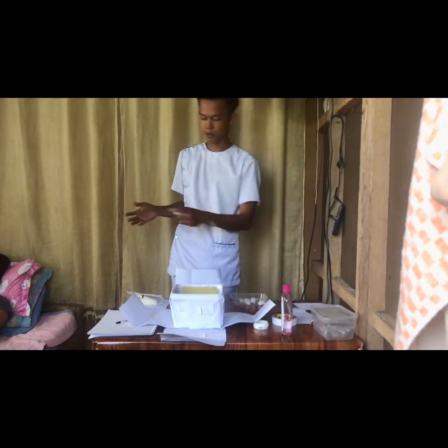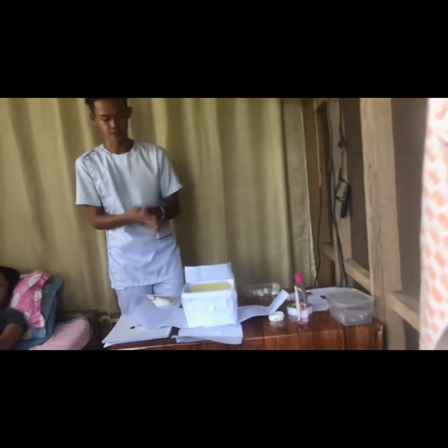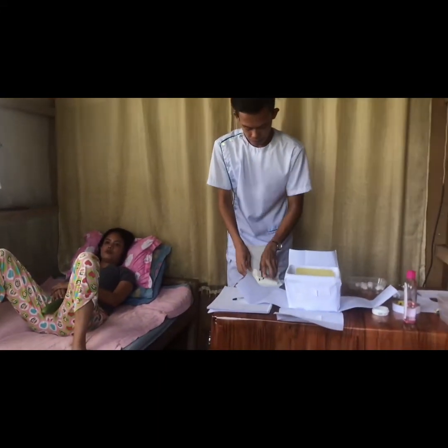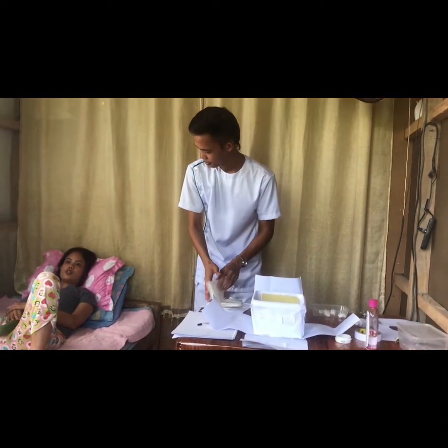So next is to do hand sanitation, and then for this time I'm going to wear the sterile gloves. So I'm just going to put on my sterile gloves, okay? Are you okay, sir? Yes. Okay.